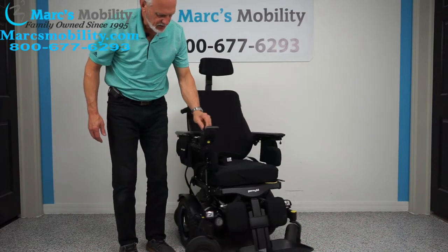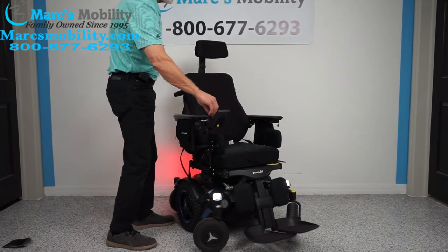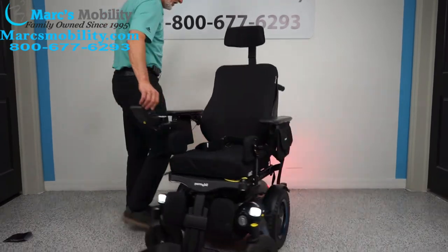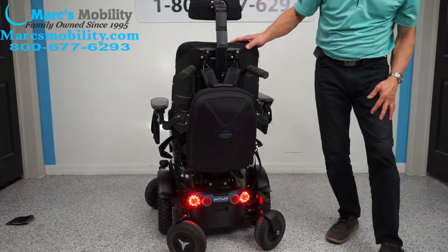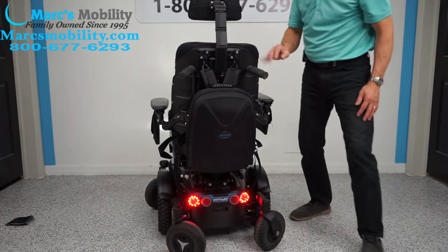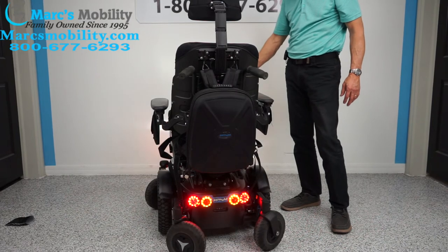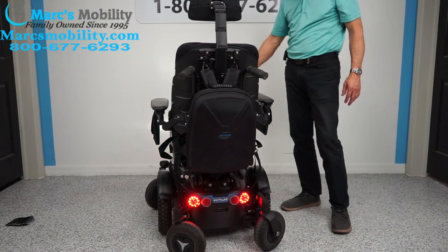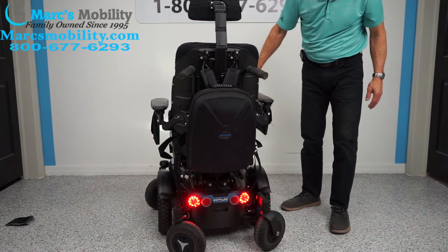As mentioned earlier, this chair has headlights and taillights — these are real lights. You can see the headlights and the taillights right here. This chair also has hazards — it has the left flasher, the right flasher. So it is fully equipped with lights.